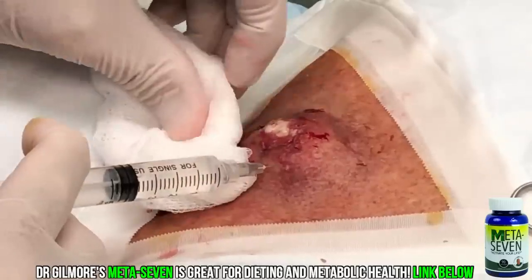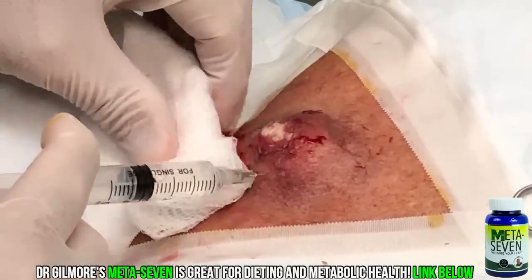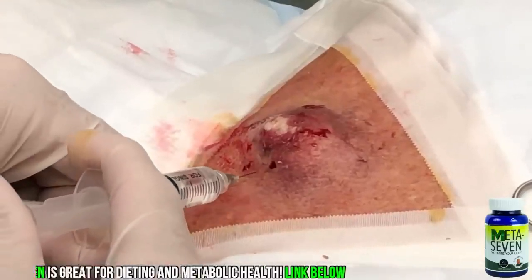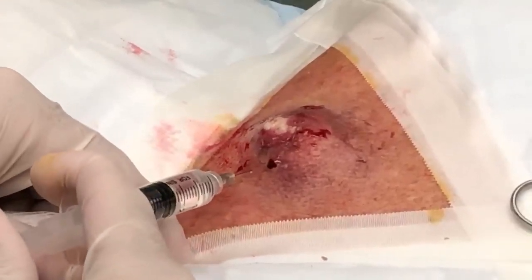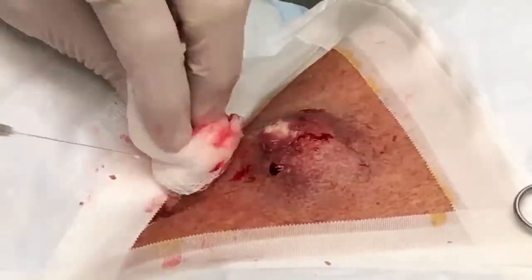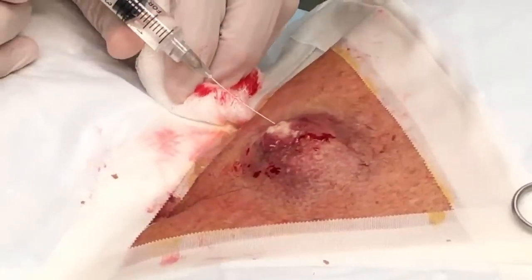If I get down, I want to get below. I don't want to get into the cyst. There we go. And in this direction. Now, if at any point while we're doing anything, if you start to hurt, you just tell me, okay? Okay. I'll use a little bit more medicine. You said you had watched some of our videos, so we don't like people to hurt, right? Yes, right. Okay.